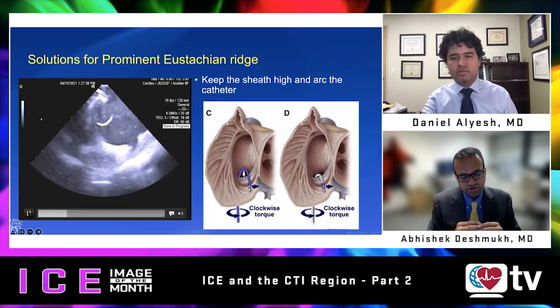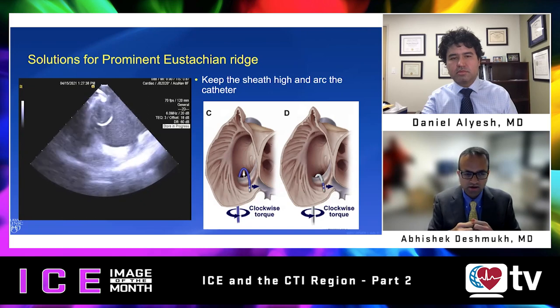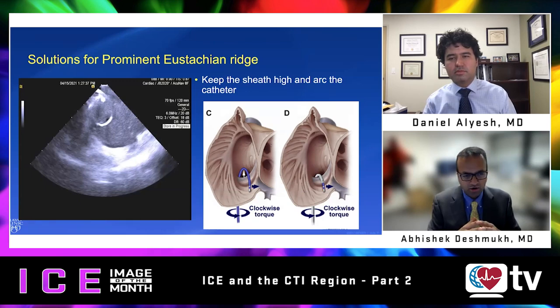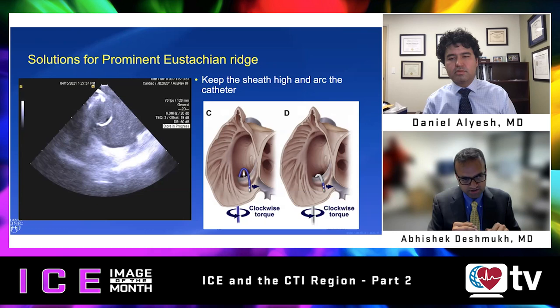A second issue is that the eustachian ridge can also have some tissue which can conduct electricity and be an impediment for creating a bidirectional block across the cavotricuspid isthmus. Intracardiac echo helps a lot to circumvent this and make sure that we are ablating in the area adjacent to the ridge and even on the ridge so that we can get a block.